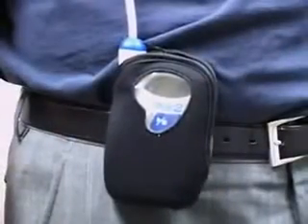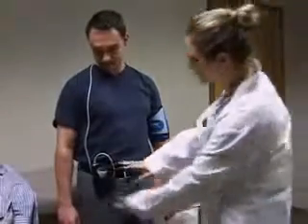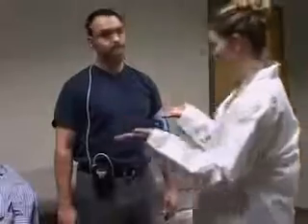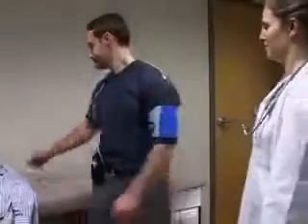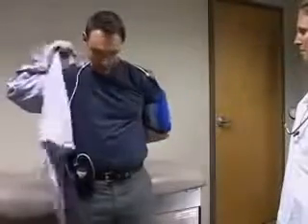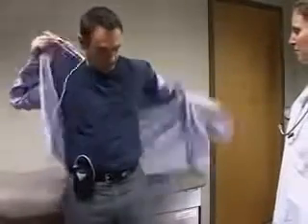When the reading is completed, the result appears on the display of the Oscar II. Even if you program the monitor to disable the display, the results will still appear for the first 20 minutes so you can verify proper functioning. Once the hookup is complete, the patient may put loose, non-constrictive clothing over the cuff and hose.